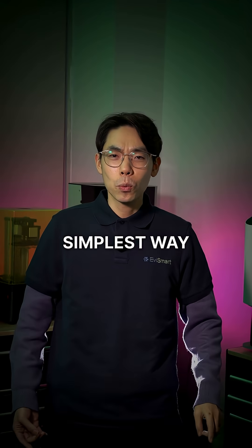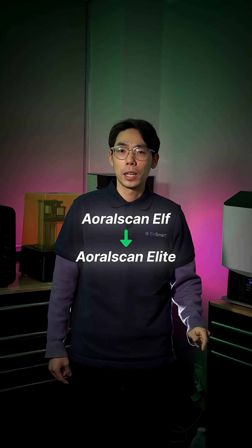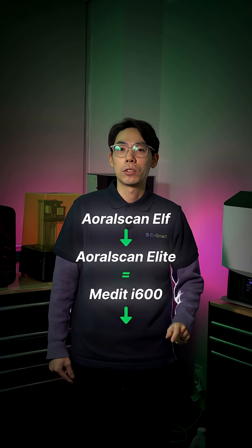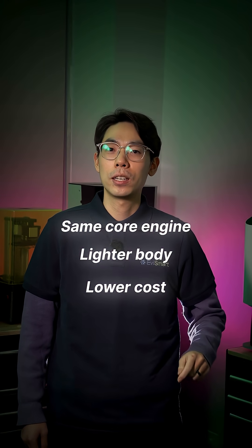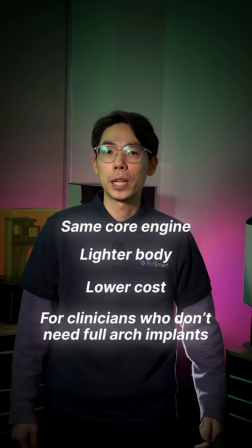Here's the simplest way to frame it: the Aoralscan Elf is to the Aoralscan Elite what the i600 was to the i700 — same core engine, lighter body, lower cost, and positioned for clinicians who do not need full arch implant features.